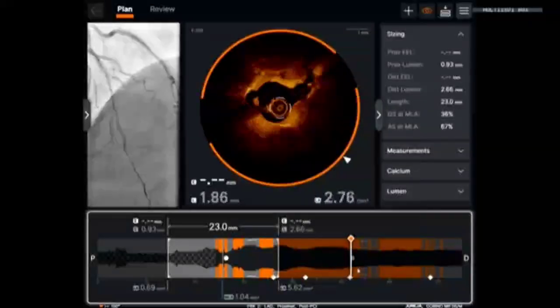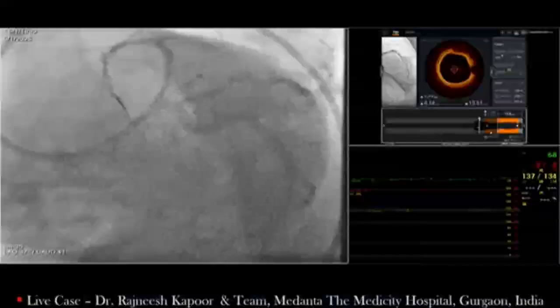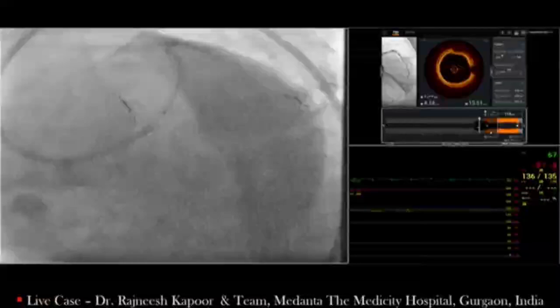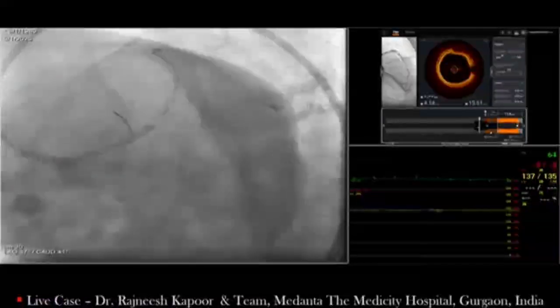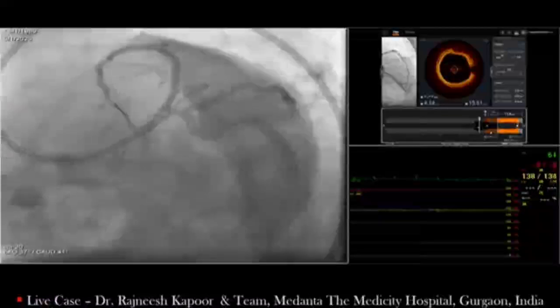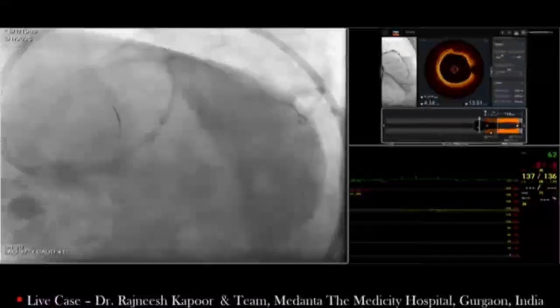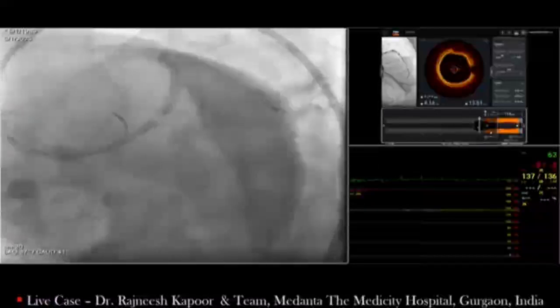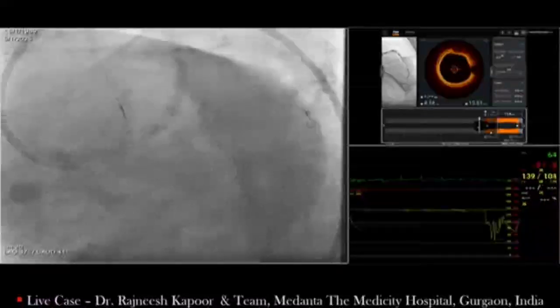I think we have modified the calcium in the vessel. But you know, obviously, we have done our own studies where we looked at the precise placement of a stent versus crossover. Obviously, crossover is recommended in 6, 8, at least in our study.